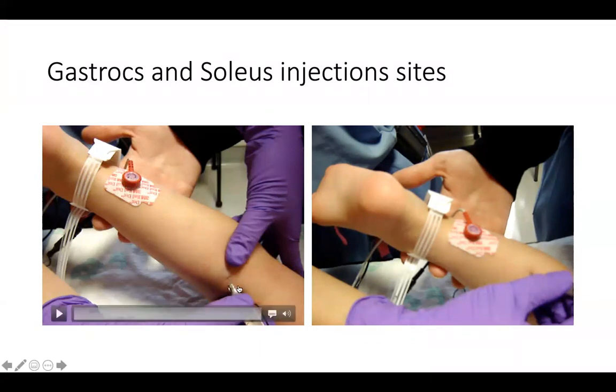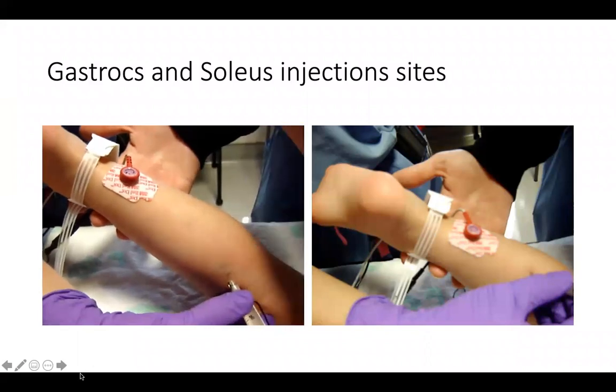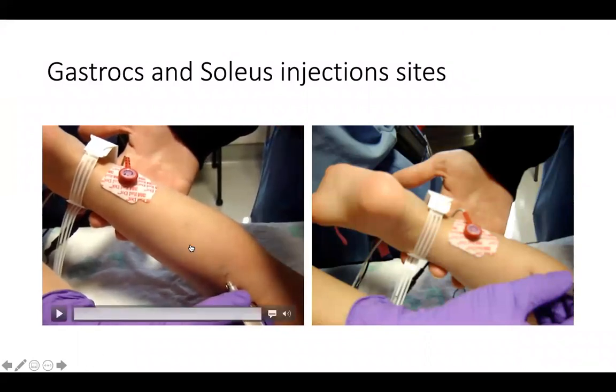As we know that gastroc motor point is proximal 1/3, this area. So I put the needle in the proximal 1/3 and look for the motor nerve, which is the tibial nerve to the gastrocs. Okay, you can see the calf was contracting, but the Achilles tendon was also contracting. So I mean the motor point of the tibial nerve to the gastrocs. I'm sorry that I wasn't able to show, but no toe was moving.